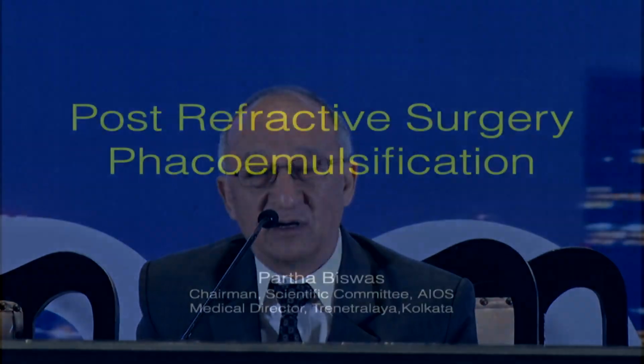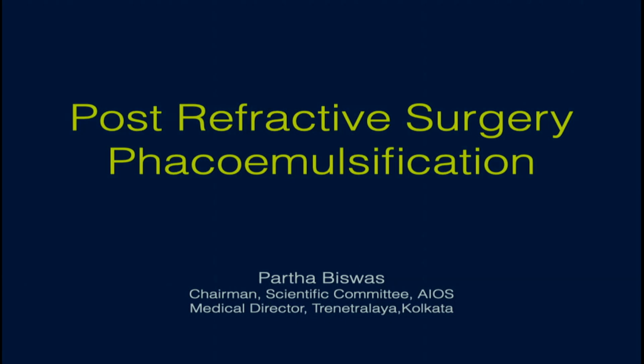I would like to invite now Dr. Partha Biswas, the chairman of our scientific committee, AIOS, to give us his own tricks and tips on another difficult situation, doing phaco in post-refractive surgery patients. Not only for doing phaco, but for getting a good outcome in terms of a good calculation of IOL power and the effective counseling which Abhay talked about, not only to the patient, but to the relatives also. All yours, Dr. Partha.